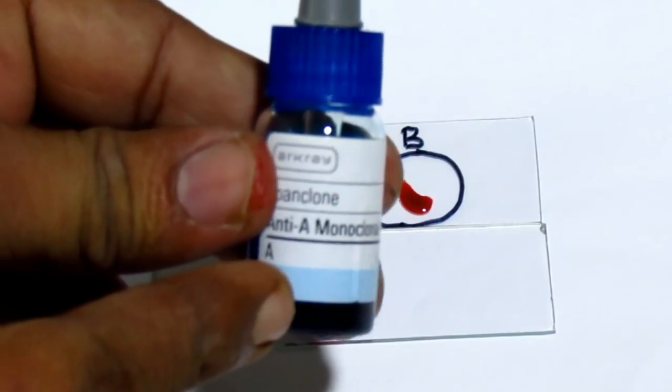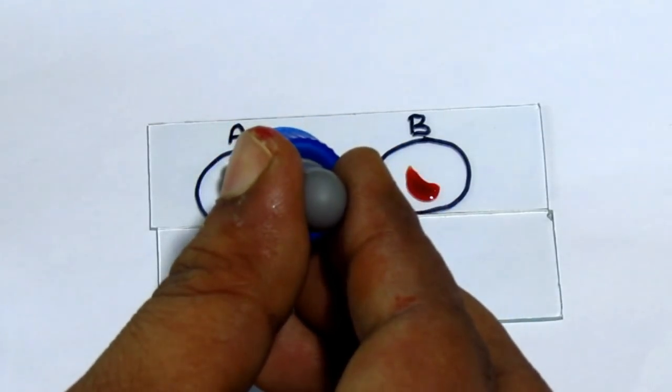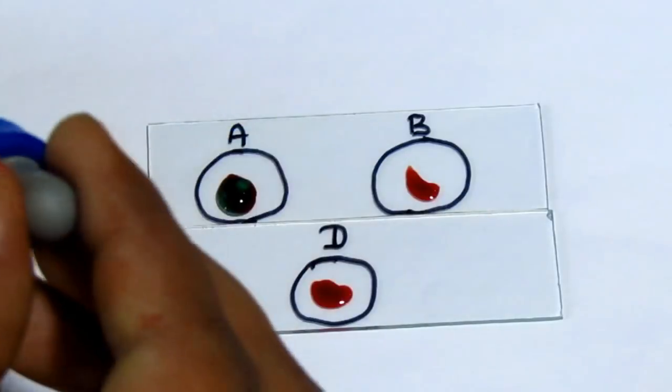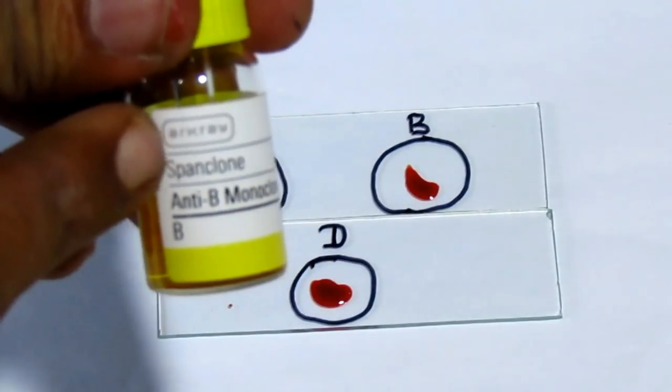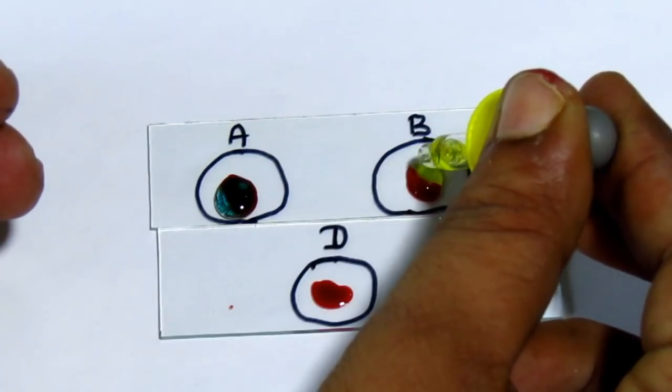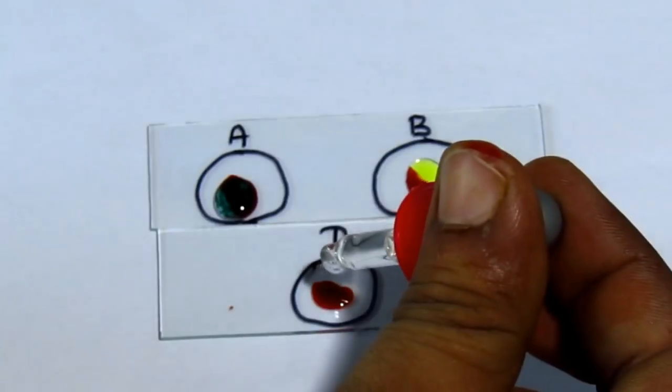Then put one drop of anti-sera A to A blood drop, anti-sera B to B blood drop, and anti-sera D to D blood drop.